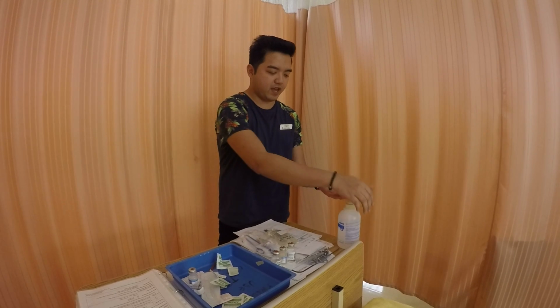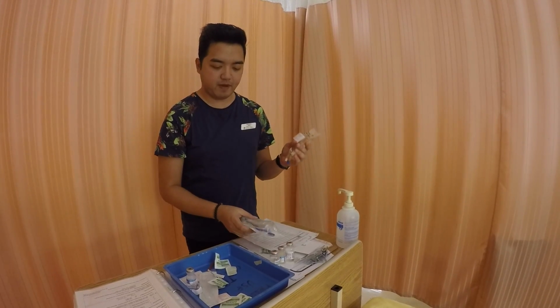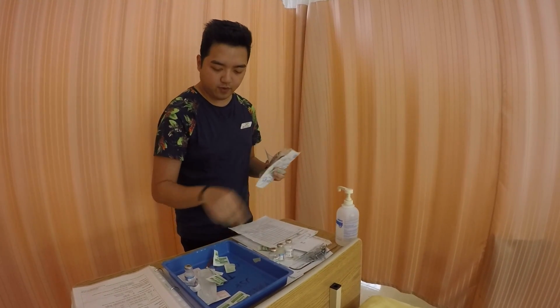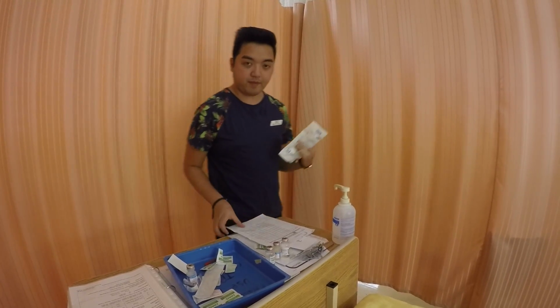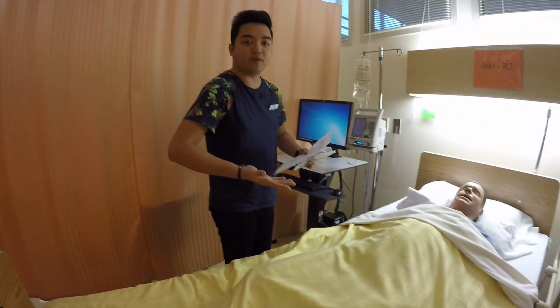So I just need to wash my hands again. Grab my stuff. So the mini bag, the secondary tubing set, an alcohol swab, and then a label for the tubing. And then my marker. And now I'm ready. Okay. So now I'm on the patient. So this is what I do.